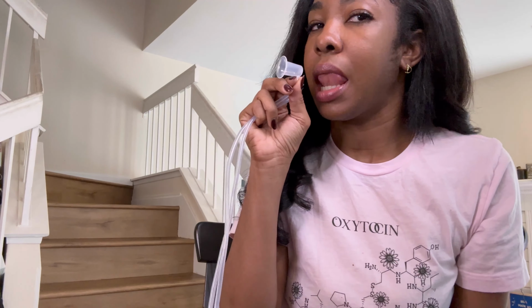If you start to notice that due to mammary gland stimulation, you'd start to notice a little bit of a clear watery substance, or you start to notice that you have what is actually colostrum leaking from your breast, that is okay. Milk production actually begins in the pregnant body between 16 and 20 weeks gestation. So if you are using it in your third trimester and you start to notice that you have a little bit of leakage, that is okay. But again, make sure that that leakage doesn't go back into the tubing of the device. And you can always collect or harvest your colostrum by saving it in the freezer and taking it to your birth.